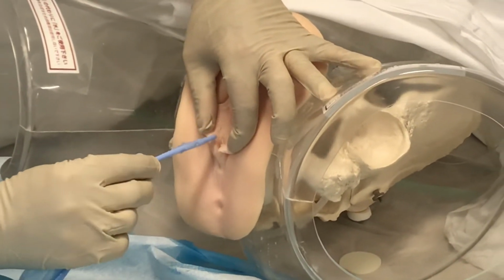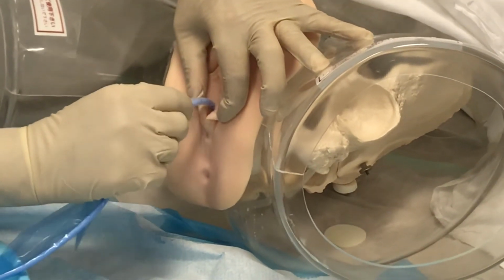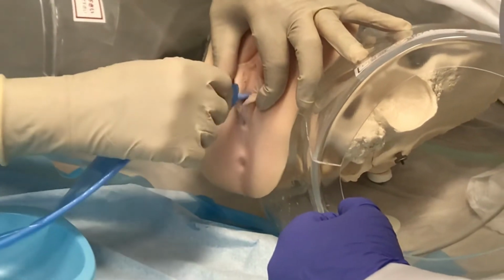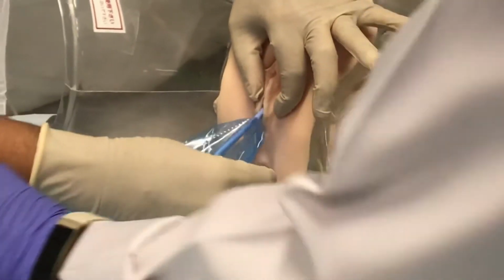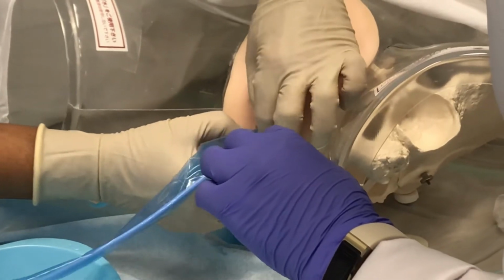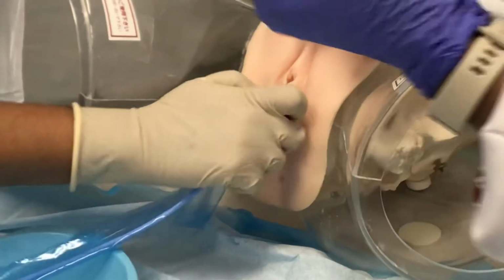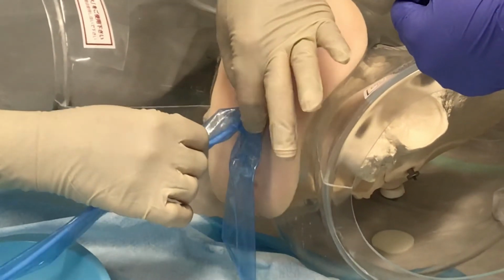So just try. This is very difficult over here because this dummy, we use it for one whole semester, only we are the ones who will be using it. Yeah, patient is nicely exhaling. My one hand is unsterile. Vaseline. Very greasy, yeah, Vaseline, it sticks. So, almost reaching.